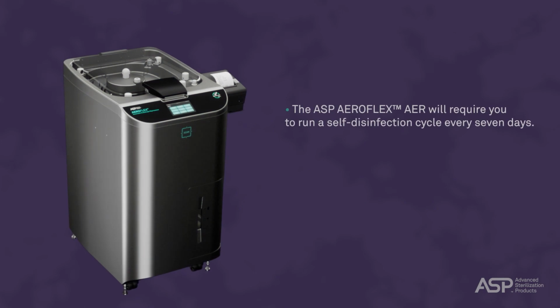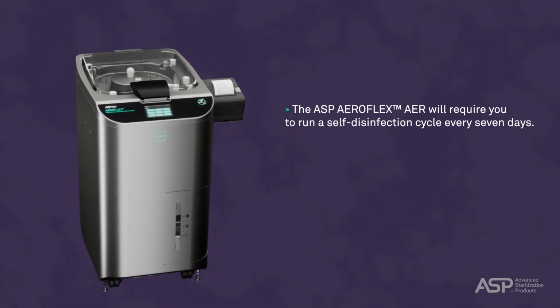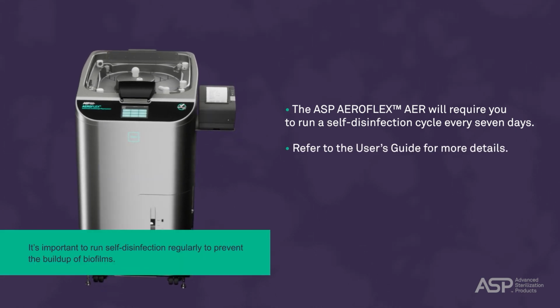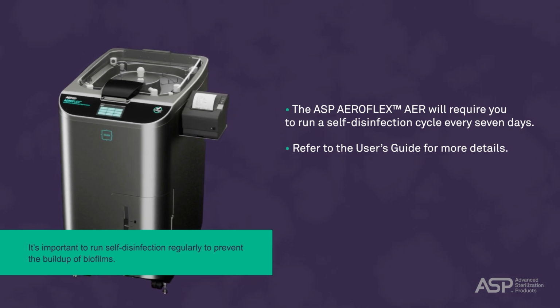The ASP AEROFLEX AER will require you to run a self-disinfection cycle every 7 days. Refer to the user's guide for more details. It's important to run self-disinfection regularly to prevent the buildup of biofilms.